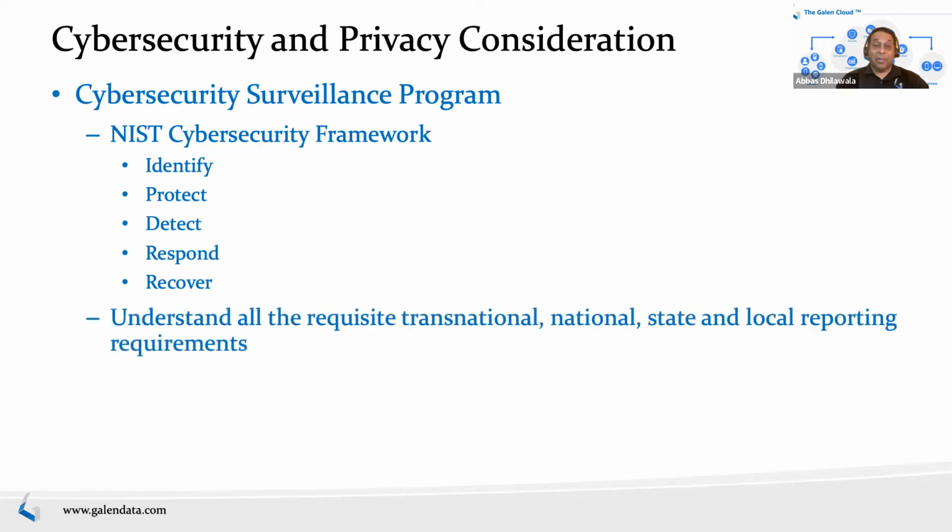I said, understand all the requisite reporting requirements. Important, because there are so many and they're so different depending on where you are, based on local, state, national, or international requirements. And then cross-functional teams are very important to have, because there are aspects of recovering that are not just from a security point of view, but from a functional point of view, a regulatory point of view, a quality point of view, a customer success point of view. So you do need cross-functional teams to be able to respond and recover.